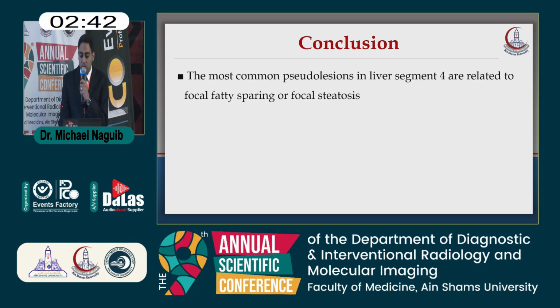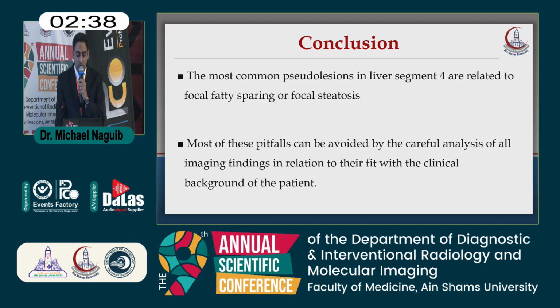The most common pseudolesions at segment 4 are related to focal fat-sparing or focal steatosis, and most of these pitfalls can be avoided by careful analysis of all imaging findings in relation to their fit with the clinical background of the patient. Thank you.